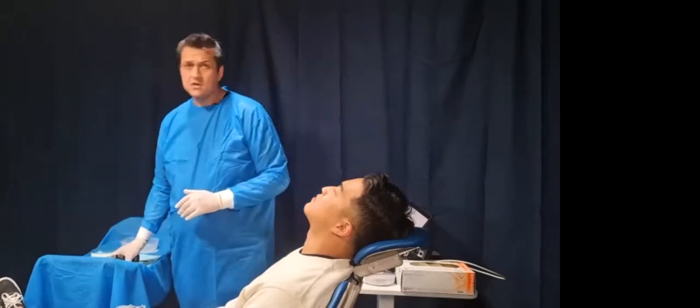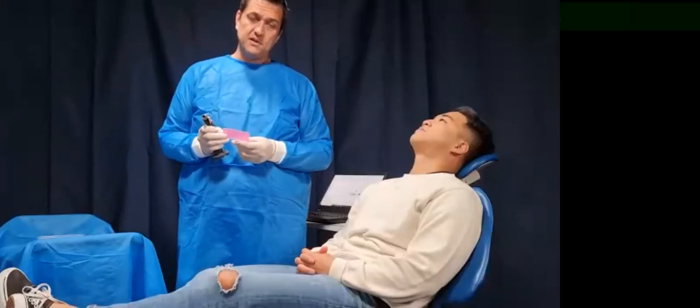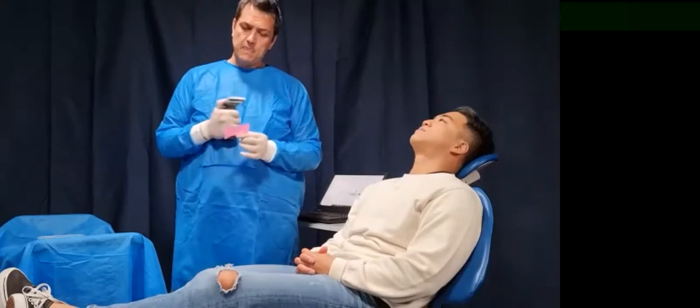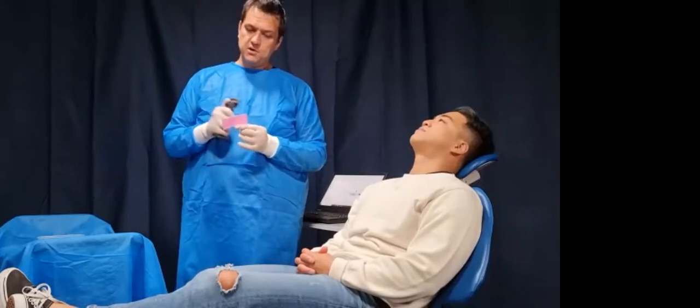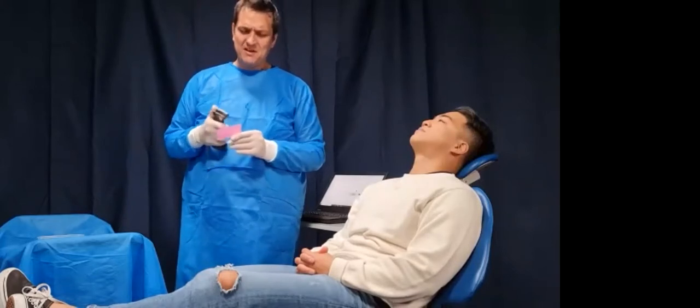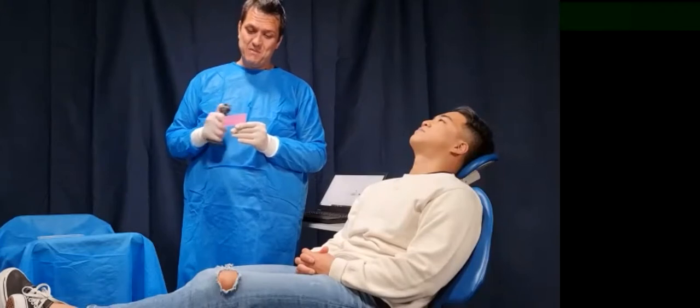The next step is grab your wax again. Now you've got your little wax piece, whatever you've got left there. Now this is the critical stage. You want your wax to be nice and soft, but not dripping, but not too soft. I'm not really being very specific here, am I? But anyway, we want a nice covering of wax. But this is the trick. This is the trick I want you to remember now.